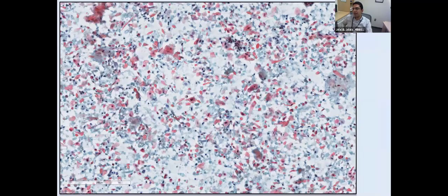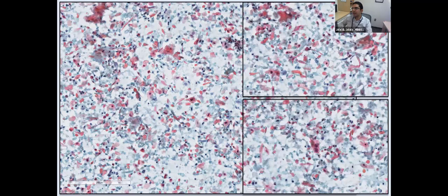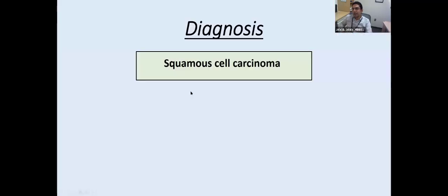The Pap stain also confirms those findings, highlighting the necrosis, but it's also nicely highlighting the squamous nature of this lesion with this orangeophilia in the squamous cells. Definitely hyperchromasia in a lot of these cells, indicating that they're abnormal, and you can see here a nice fiber cell that is diagnostic of squamous cell carcinoma.